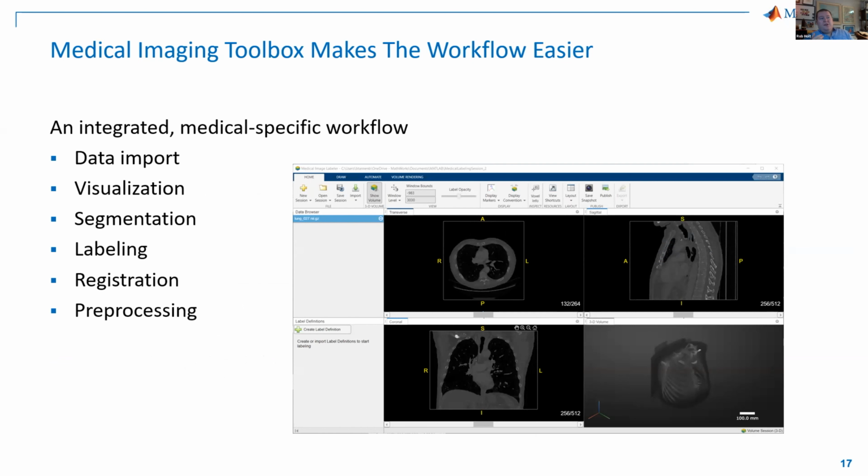So you might be able to tell from here that the anatomical orientation and labels are there, that the 3D imaging kernel has been updated and it looks a lot better. And what I'll go into is a little bit more about labeling, registration, and pre-processing specifically. But one of the big take-home messages is that our visualization kernel itself has been updated and now is also GPU accelerated.